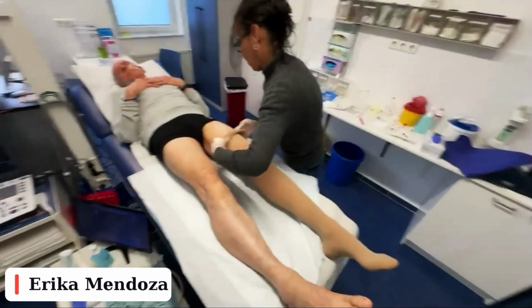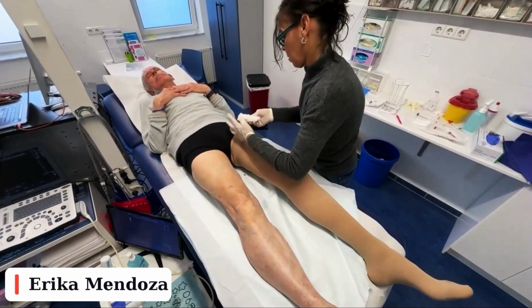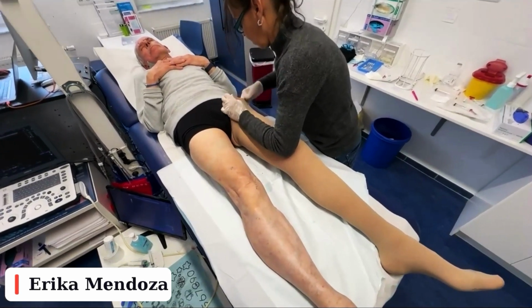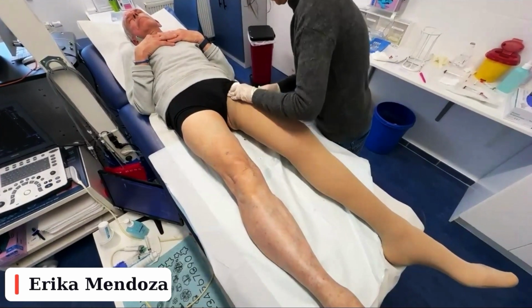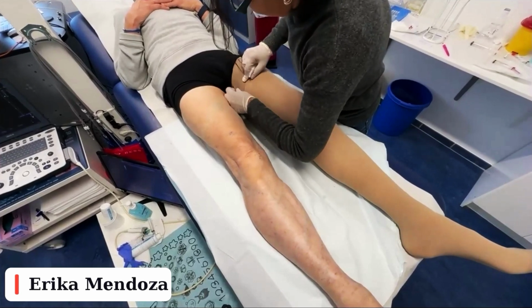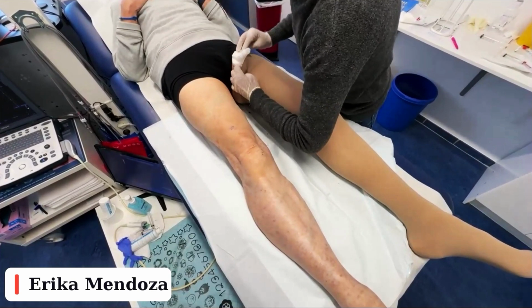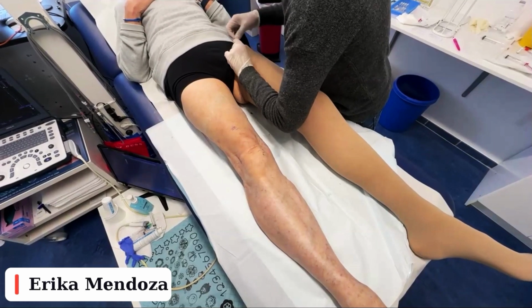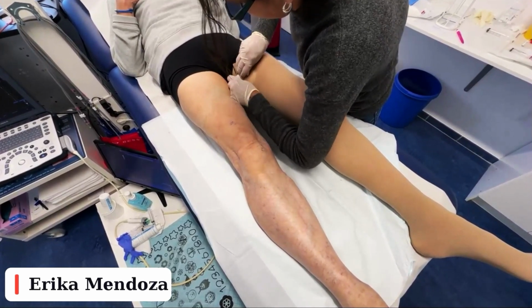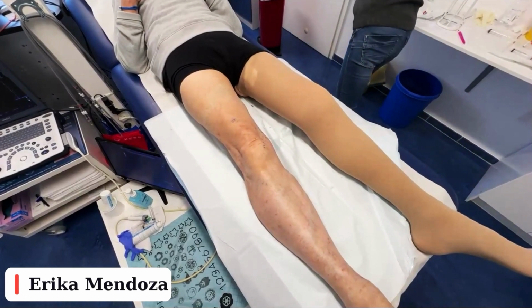So we have the stocking until this point, as high as possible. We put extra bandages there, fixed by the trouser, and then we put the other one on top. And I think that this could help keeping the things closed. And you see, even if everything is being performed, the patient at least is 5 to 10 minutes recumbent before he gets up. And sometimes I say something in German, Kopf runter, put your head down, because if you put the head up, you really press with the stomach muscles and you put the blood back to the leg.